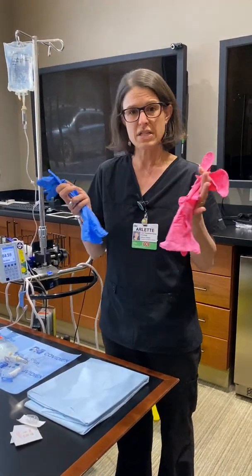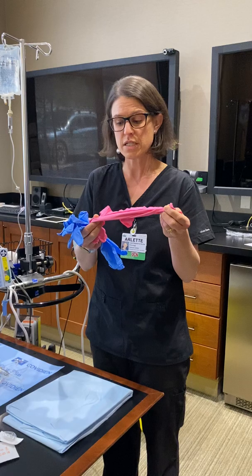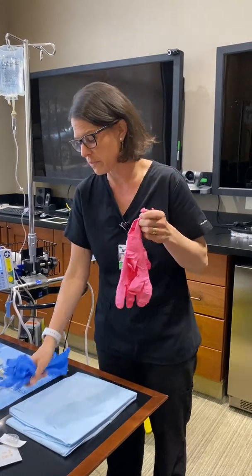You need two sets of chemo-certified long cuff gloves. We have these pink gloves — if they're not in stock you can use two sets of the long cuff blue gloves — but these are made to go underneath; they're nice and slippery for double gloving.